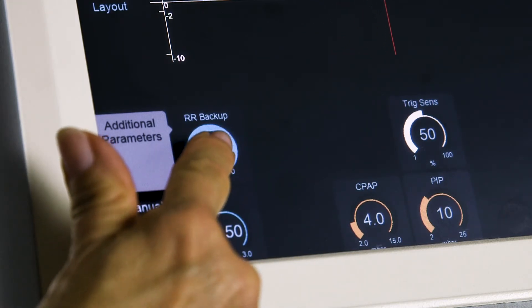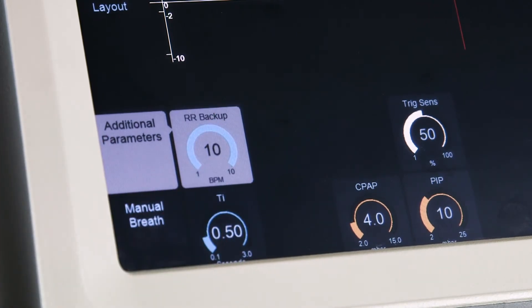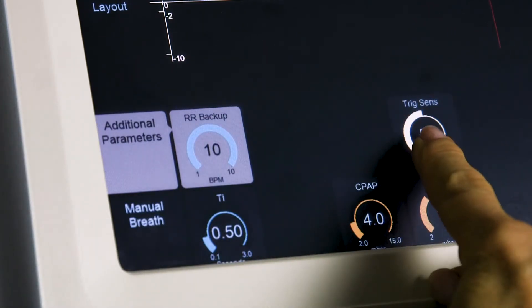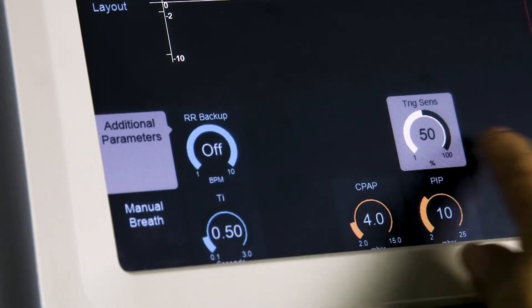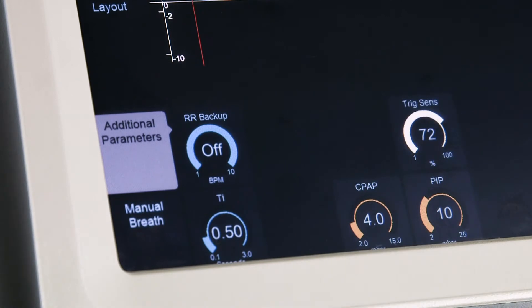RR Respiration Rate Backup: Push and hold to enable the backup rate for apnea. Trigger sensitivity adjusts the threshold for breath detection, which is the effort required by the patient for the ventilator to recognize the breath. The higher the number, the greater the sensitivity to detect small breaths.